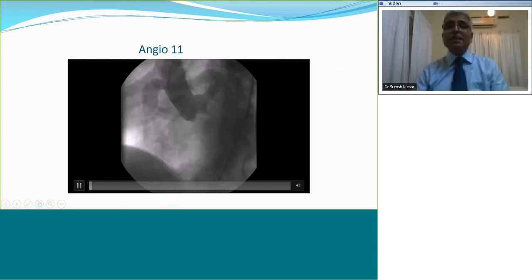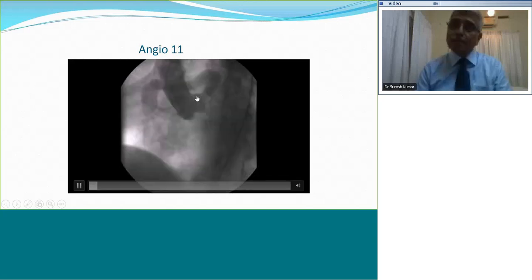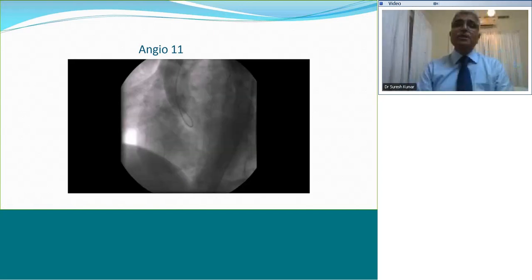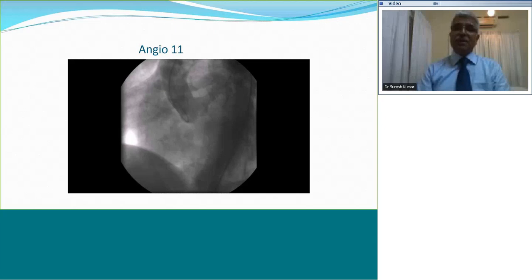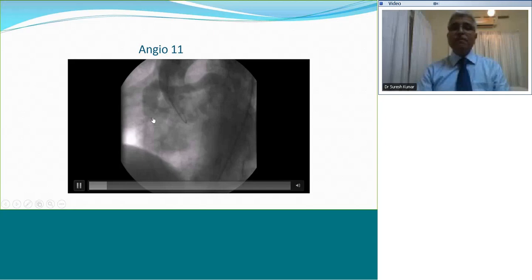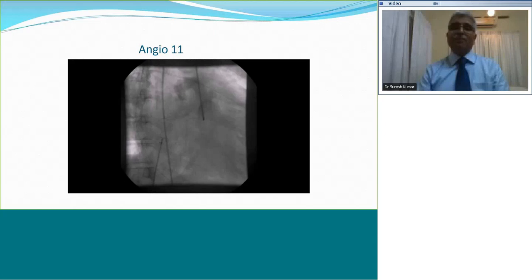You know for sure that this is coming from the left sinus, but you do not know whether it is coming from the left coronary artery or from the left sinus. And take it from me, this type of fistula more often comes from the left sinus rather than from the left main coronary artery. So this is a huge fistula from the left sinus going behind the aorta and draining into the SVC-RA junction. Now if you see something that is popping into the fistula, can you see this? Where my marker is? There's something there. That is the treatment that is being done. What is it?